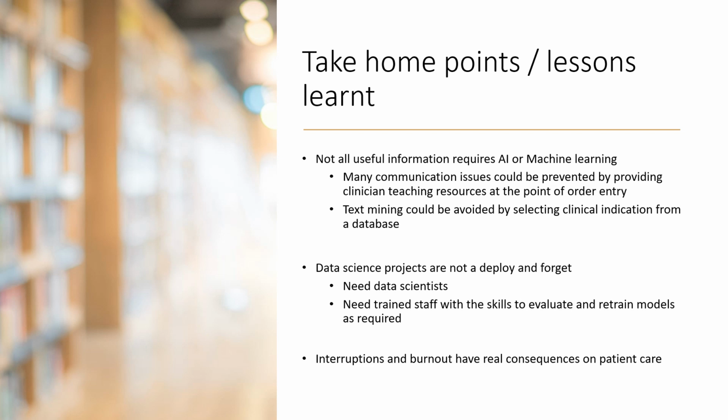It could be simple tools. The text mining, pulling the topics out of information, that could be avoided if there was instead a drop-down box when the clinician was ordering that allowed them to select why they wanted the scan done, such as acute head injury.